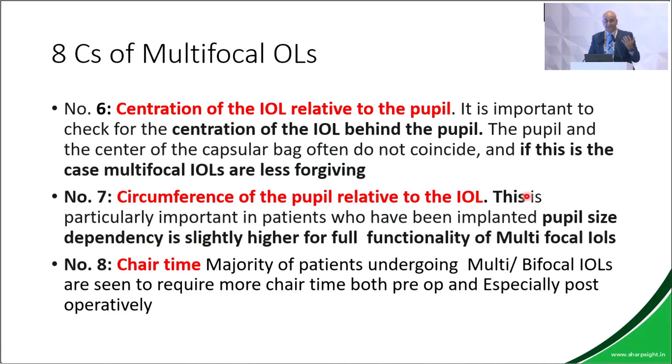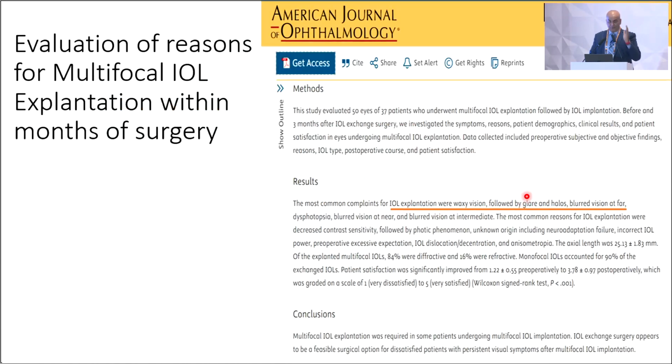So these are the reasons why I actually started moving away from multifocals. In my practice, multifocals are mostly implanted in patients where I've done a multifocal earlier, and he was happy. Otherwise, I'm not. Multifocals are very, very intolerant to bad pupil sizes, and of course, need more chair time. So these are the 8 C's why I'm shifting away from multifocals.